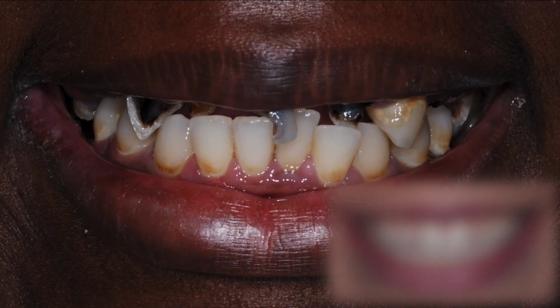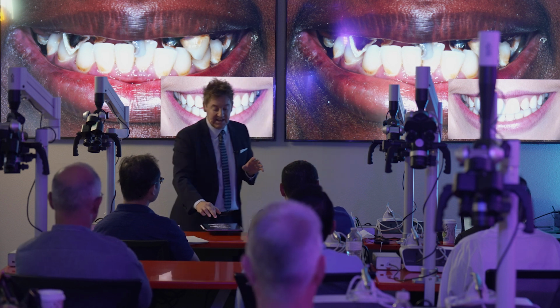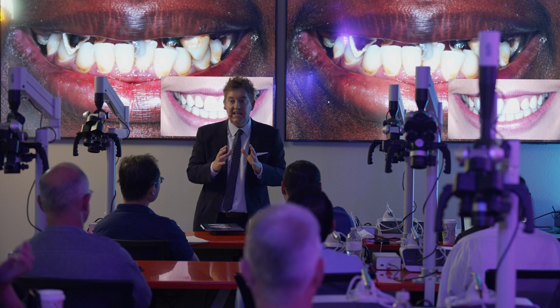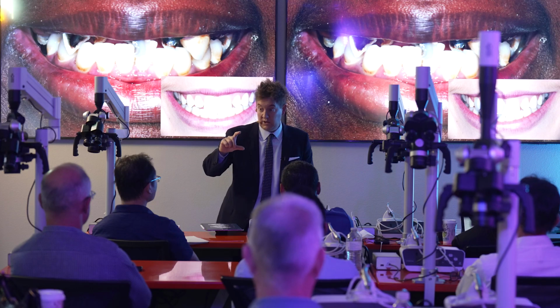All right? So let's do one together. When I see something and I'm like, man, that just doesn't look right, I put someone of the same age and same sex next to our patient and then start drawing in teeth using templates that I give all of you in our photography and our workshops. The 30-year-old, which we're dealing with here, when they go to rest, they show on average 3.3 millimeters, okay?